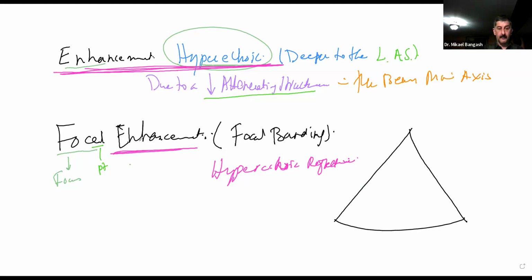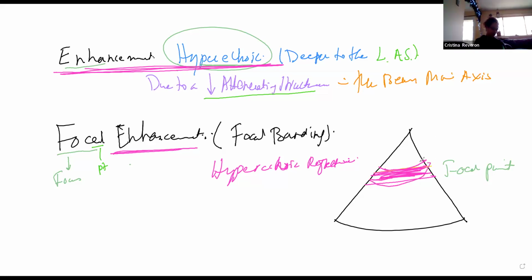An enhancement, which is a hyperechoic reflection. Where? At your focal point. Did you guys get that? Yes. Okay.